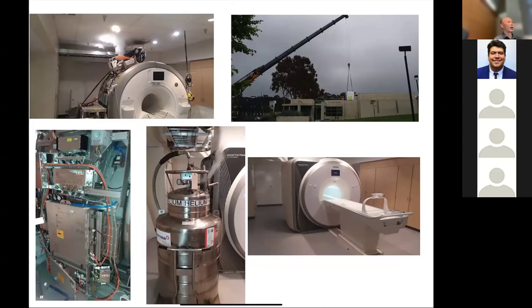Okay. The other time you quench a magnet is if someone gets stuck in the magnet and it's a life endangering situation, then there's a button you can press. But you should never press that button unless you are sure, because it's very expensive to quench a magnet. You're talking about a $50 to $100,000 decision if you press that button. Okay. If someone's dying, obviously you press the button. But one time we had a spool of wire that got stuck in the magnet because someone forgot. And I'll show you some examples of why you should never do that. But there, we did not quench the magnet. Instead, we tied a lot of ropes to that coil, and we had a bunch of people slowly pull it out. And luckily, we were able to do that.